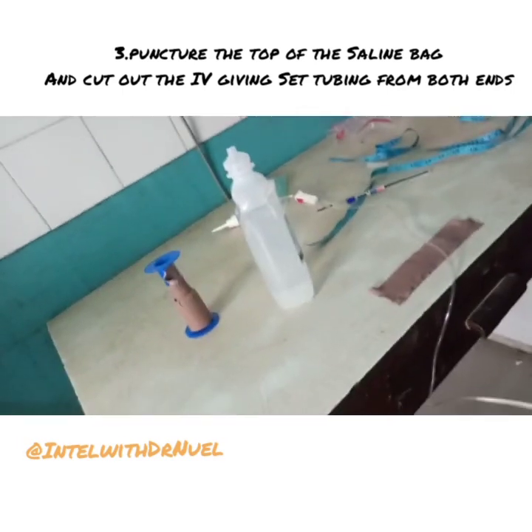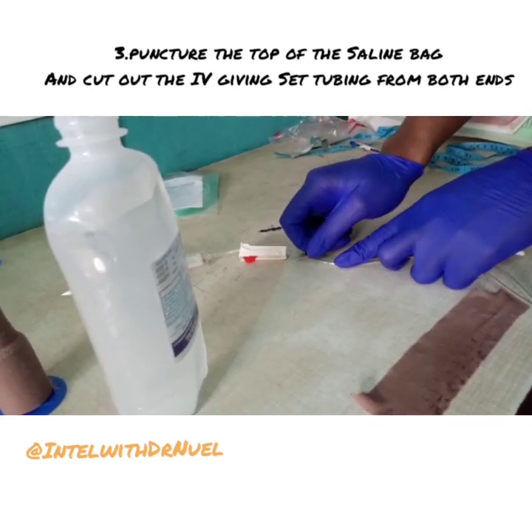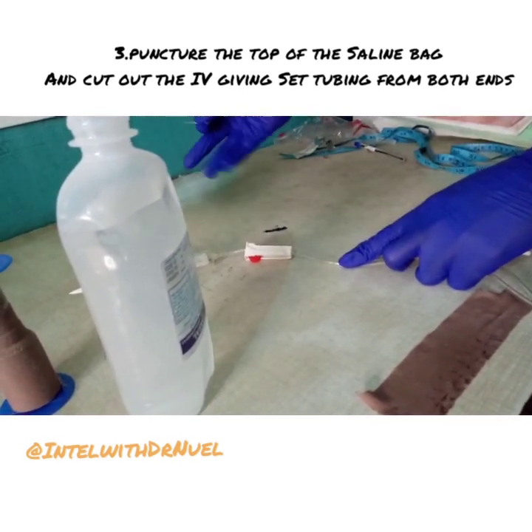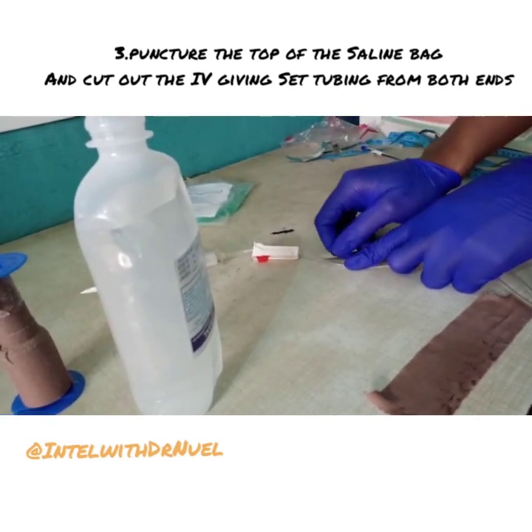That's what we have our blade for. Notice we are not cutting straight like this. We are cutting at an angle because some nasal prongs are big. So for it to fit, if you put it straight, it won't enter inside. So you cut it at an angle.